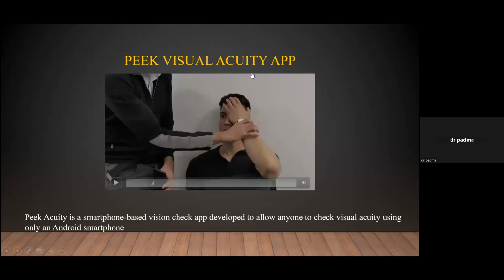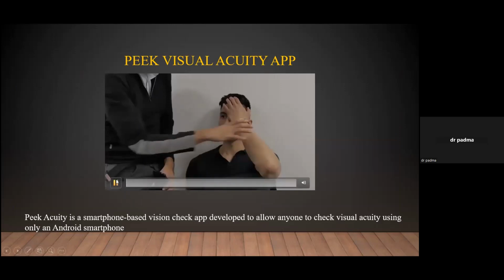And there is an app which can be downloaded from the Google Play Store for vision testing. It's called the Peek Visual Acuity app, and here's a video of how it can be used.